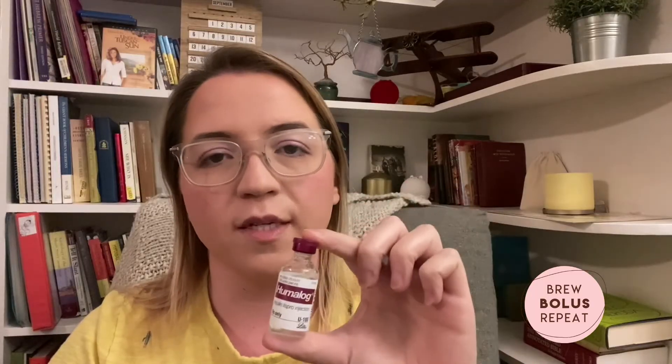The meter also came with a lancing device and 10 free test strips. So for tomorrow I've got my PDM, my pod, and my vial of Humalog. This will act as all of my insulin — I won't use Lantus anymore at all, just Humalog only. I've got some alcohol swabs to clean the site. I think for the first time around I'm going to put it on my arm. I'll try to check back in with you after I have my meeting with my pump trainer. I'm not going to take my dose of Lantus in the morning like I normally would, because you have to go 24 hours without your long-acting insulin before you can start.